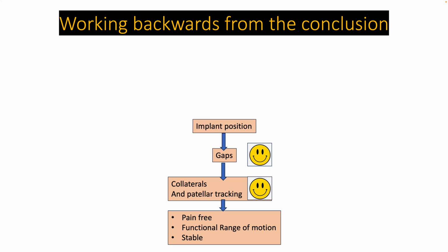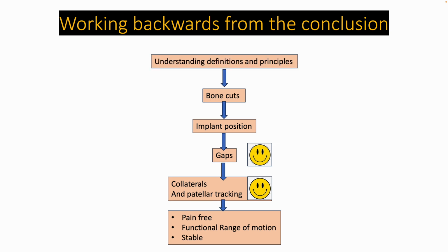And this in turn depends on the implant position. The implant positions, of course, depend on the bone cuts. And the whole idea of where you make the bone cuts will depend on your understanding of the definitions and principles related to total knee replacements.